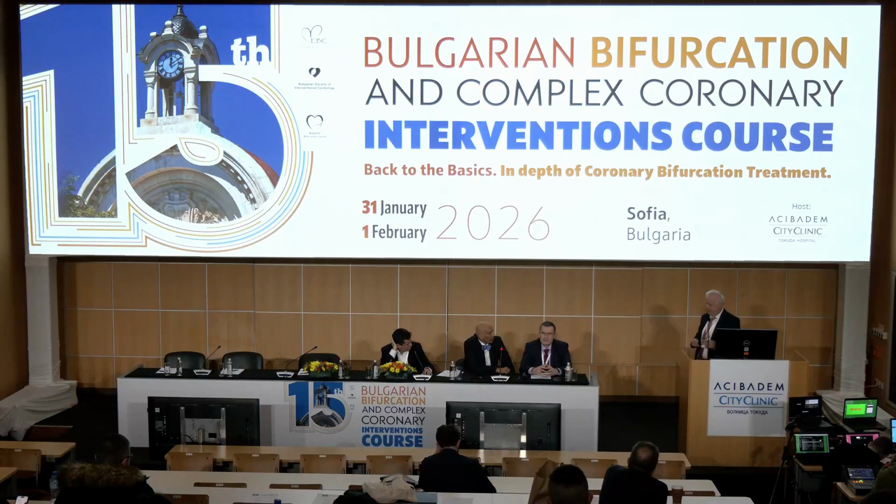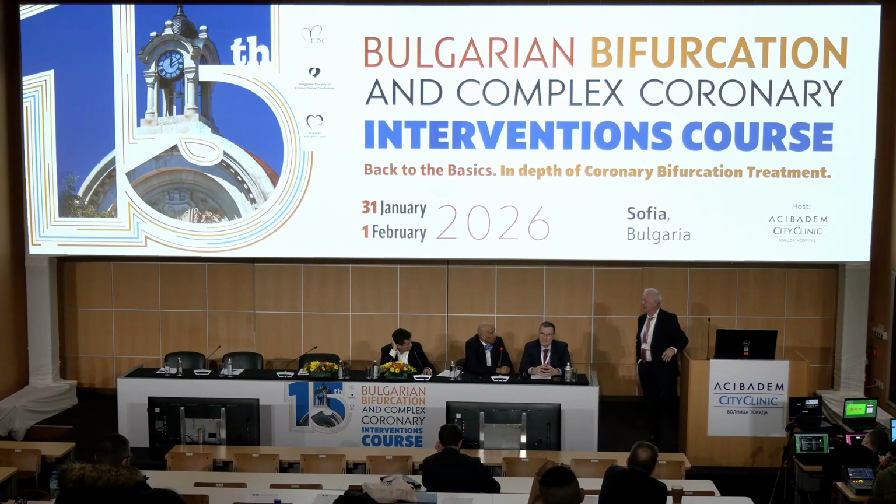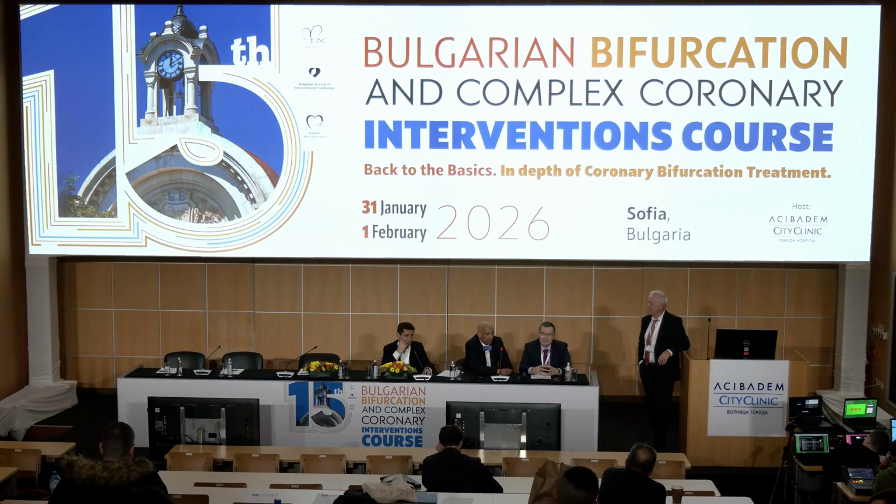Thank you very much. So Yves, I have a question. QCA is all computer generated on angiography, right? Yeah. So there may be some situations, for example straight segments, where, since the correlation between QCA and OCT is close, QCA is good enough and you don't need intravascular imaging.